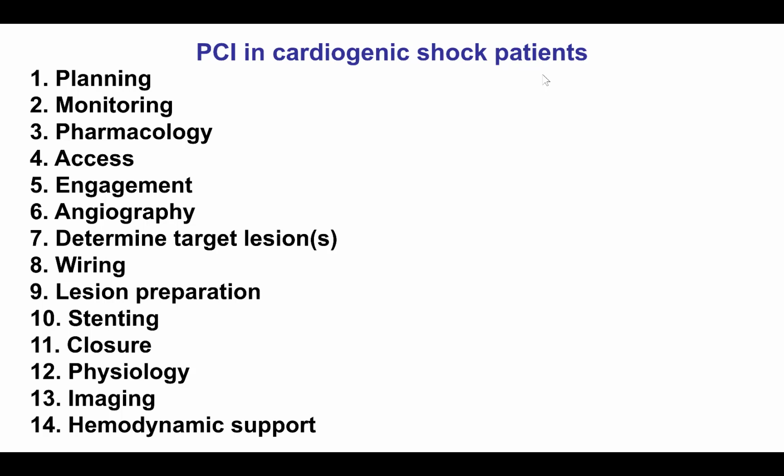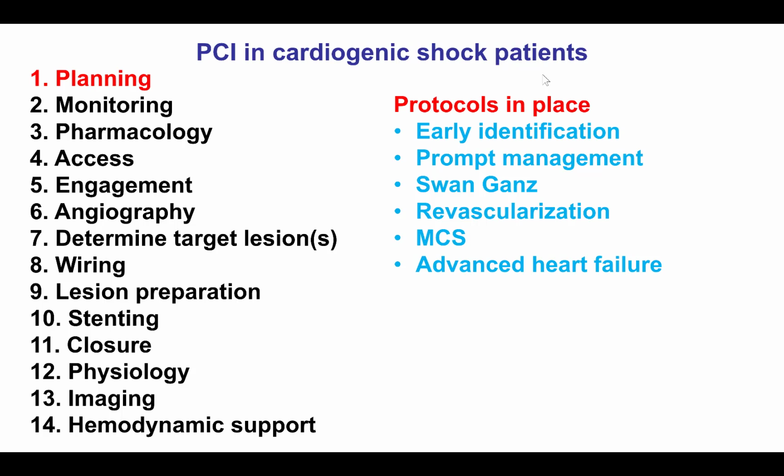How do the 14 steps of PCI apply to patients who have cardiogenic shock? We'll start with planning. Planning is critical for being ready to treat patients who have cardiogenic shock. And the importance of protocols cannot be overemphasized.